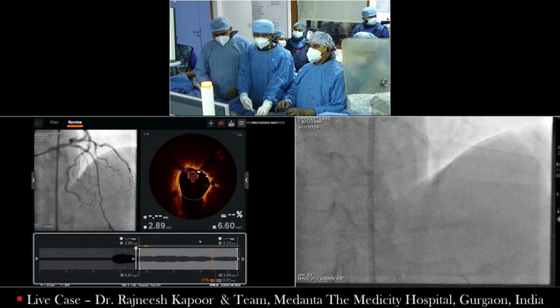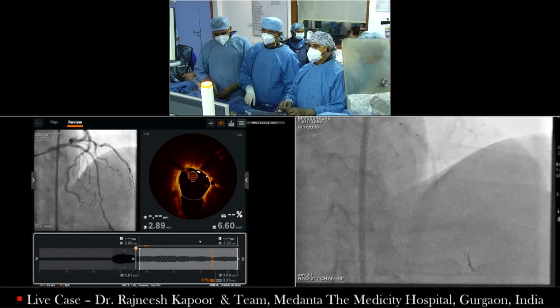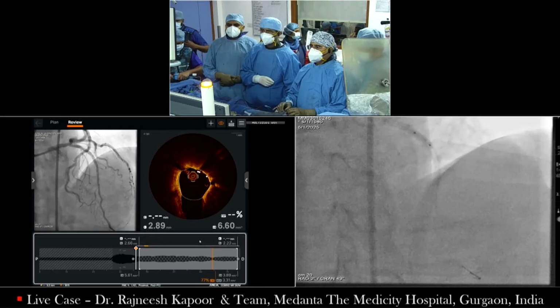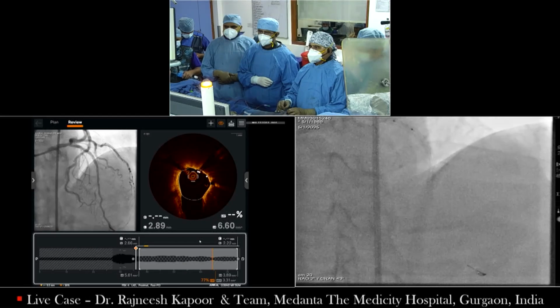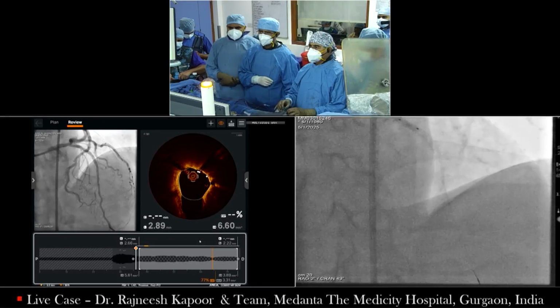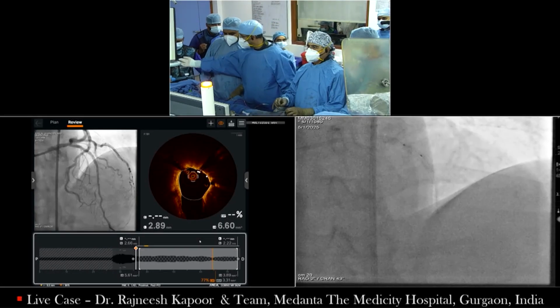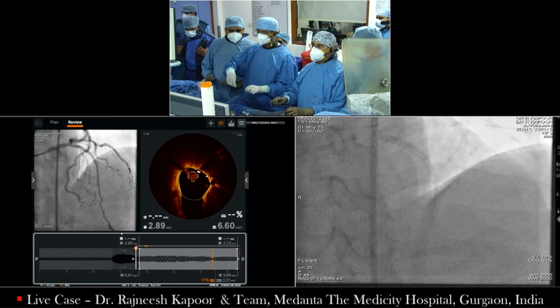No, I just want to re-emphasize the importance, and also how we saw in all these cases this morning, because the previous session was also calcified lesions, how intravascular imaging is so important in trying to plan the procedure and how adjusting the procedures accordingly, because we have done a lot of adjustments according to intravascular imaging, not only in left main bifurcation, which was the first case this morning, but also in mid-LADs and long lesions. So congratulations to both Dr. Chandra and Dr. Kapoor for the great cases and great demonstration. Thank you. Yeah, thank you, Rajneesh and Chandra.